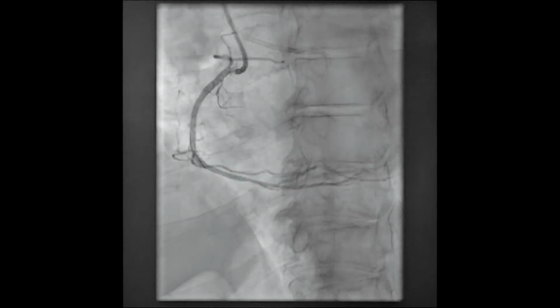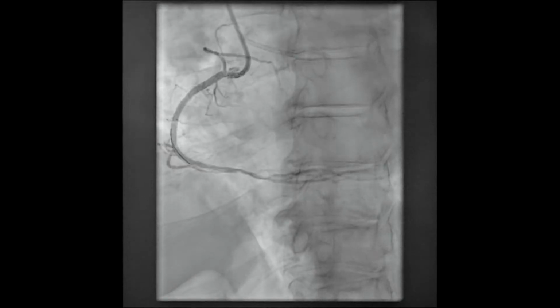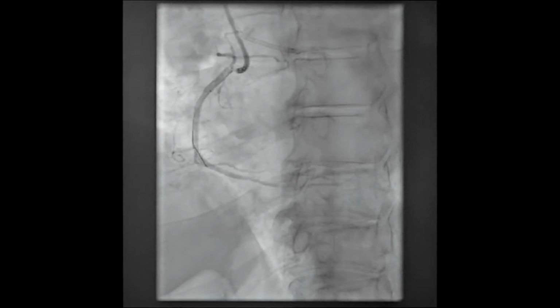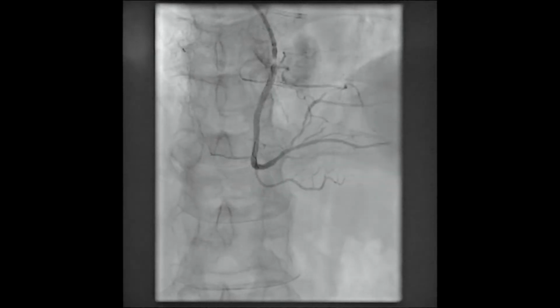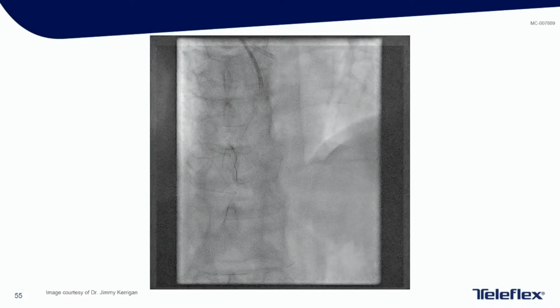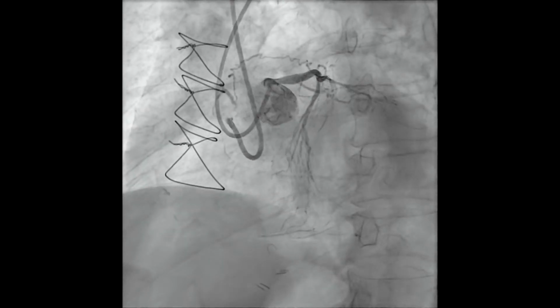We stent, we optimize, and make sure that we meet the ultimate criteria, outside the scope of this talk, for these stents. In Europe, they have the luxury of bringing these patients back 6 to 8 weeks later. In the US, we don't have that option, unfortunately, so do the best job you can at that time, keeping in mind Elias's maxim: perfect is the enemy of good at times. We don't want to induce complications. And we had good flow into the RV marginal. Patients can get pretty sick if you knock off the flow to their RV and have RV shock physiology. So that's that case, an antegrade wire case.